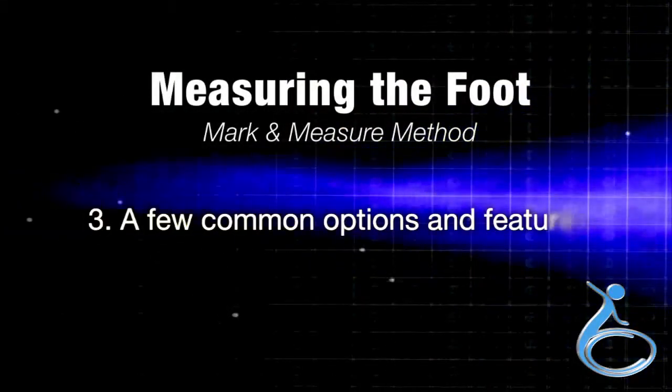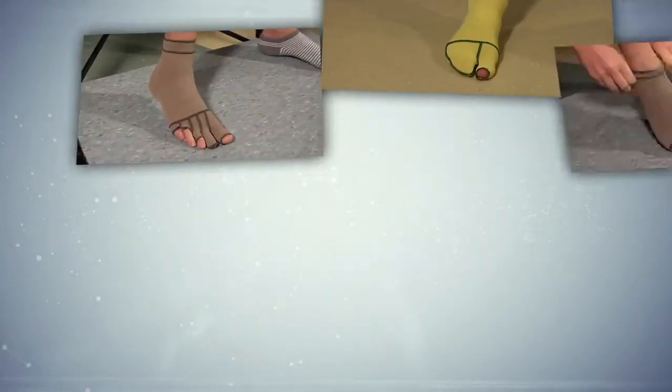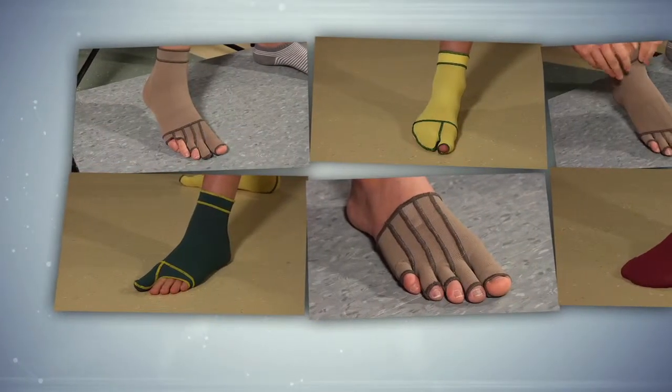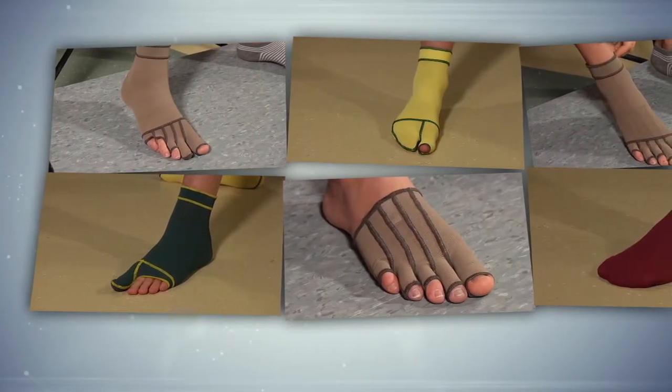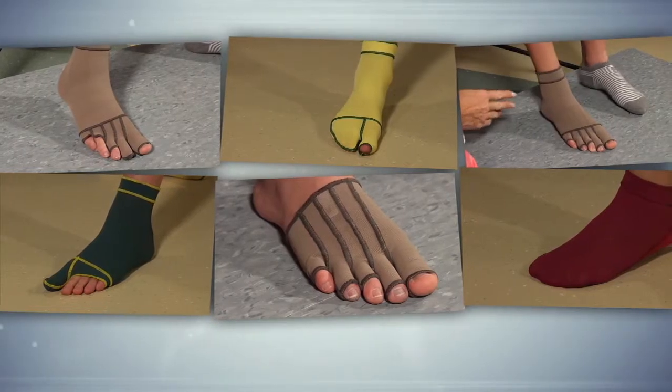We move now to Section 3, a few common options and features of the garments. Here are a few of our most commonly ordered garment styles and features. Keep in mind we have many more options and features of every style of garment. Consult the measuring manual for more information.